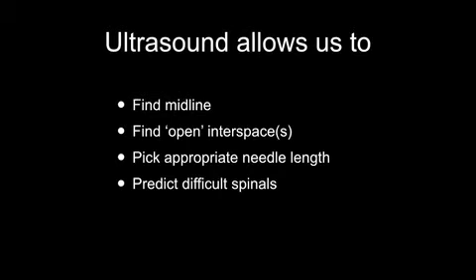Spinals and epidurals can be difficult. Ultrasound allows us to find the midline, find open interspaces, pick appropriate needle length, and even predict difficult procedures.